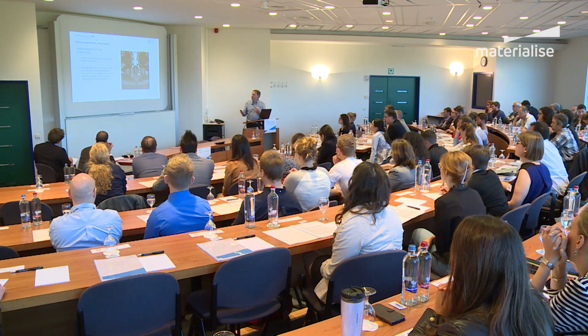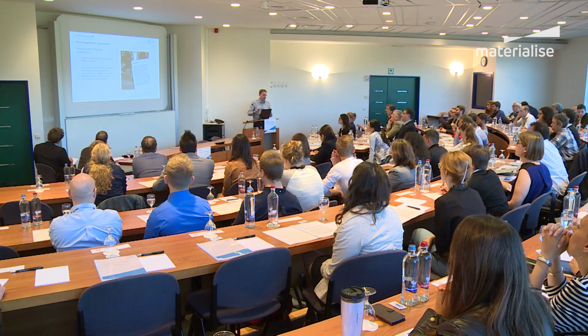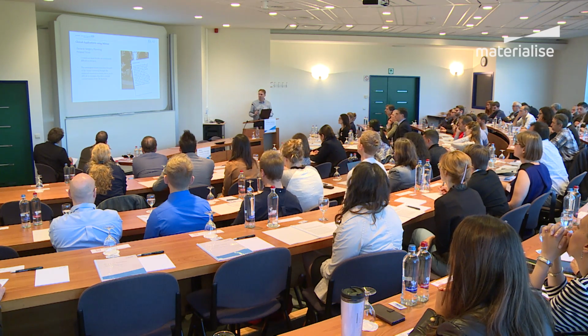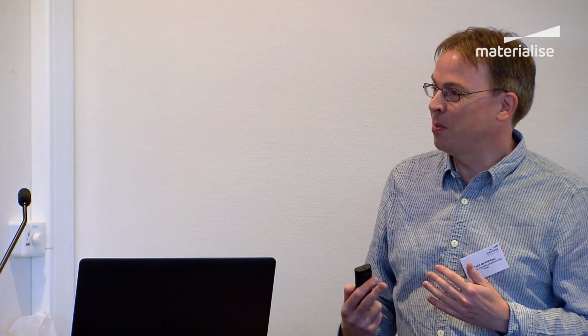Now the radiologist produces a very, very detailed report and uses a clock notation to describe the path of the fistula. But just reading through that, it's impossible to generate a mental picture of what is happening and how I am going to treat this patient. So the question we want to answer is, can we produce a pictorial representation effectively of the report?